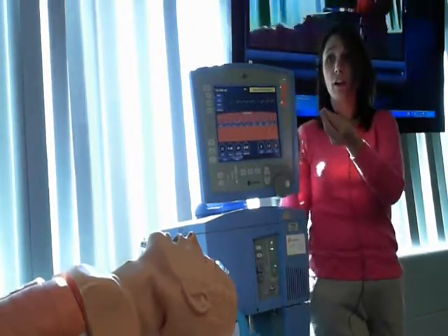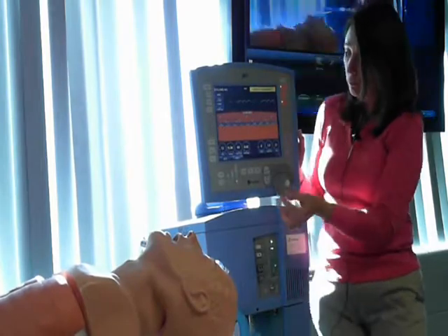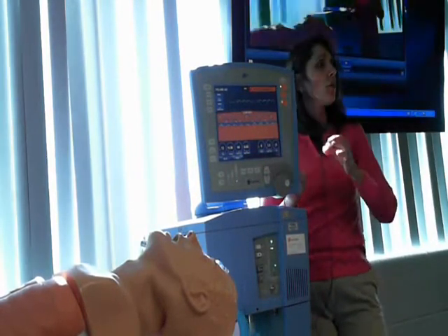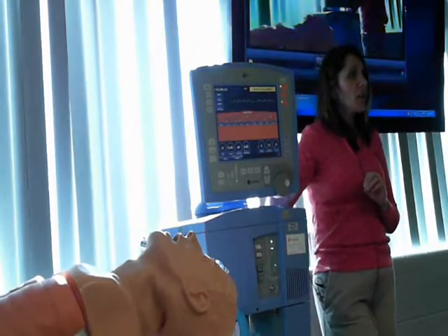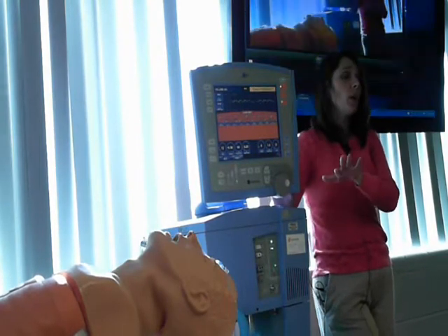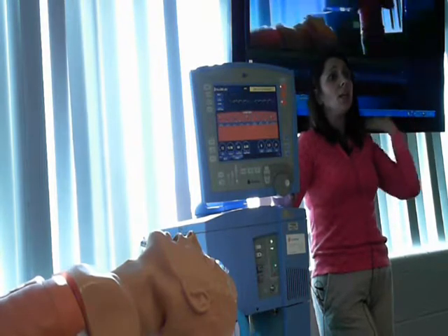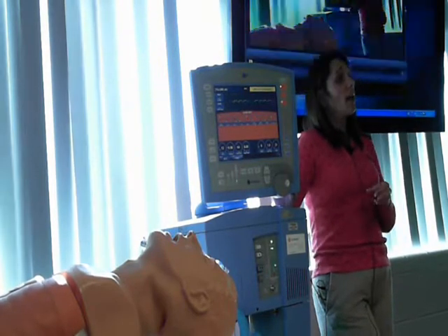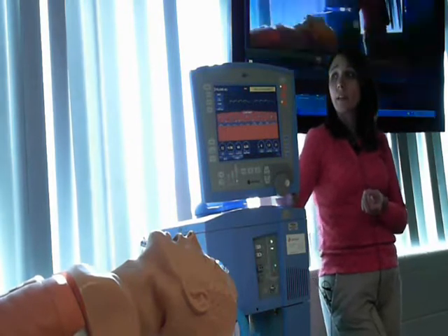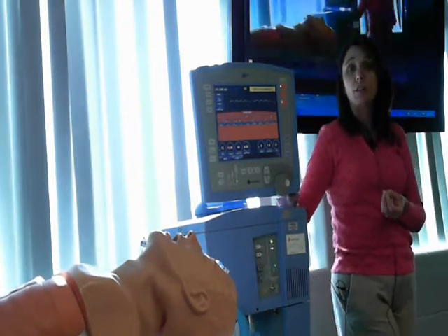And you'll be very aware if you work in critical care. So that's tidal volume. We talked about rate. Your rates for mechanical ventilation can go just like your rates when you breathe, okay? Anywhere from 12 to 20 breaths per minute is normal. The breath rate goes down as the patient becomes stronger and their disease process resolves.